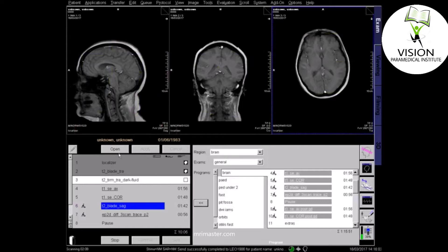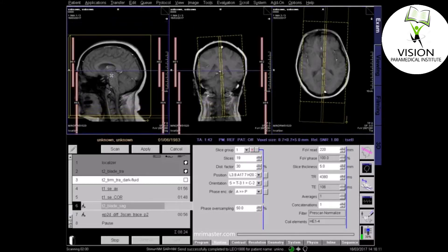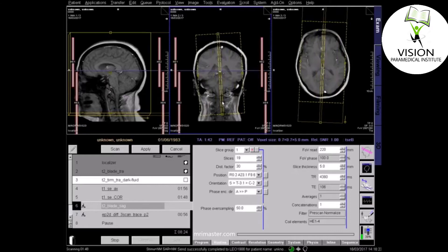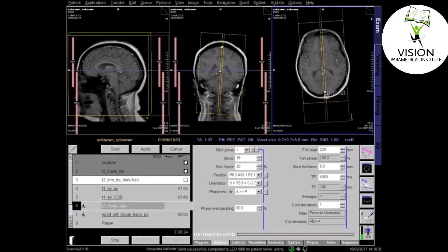Plan the sagittal sequence. Slices should run parallel to the midline of the brain. Make sure you cover the full width of the brain from side to side. Center to the midline on the axial view, and again cover from side to side.